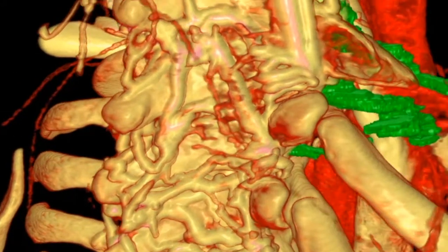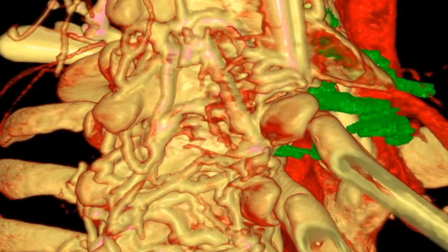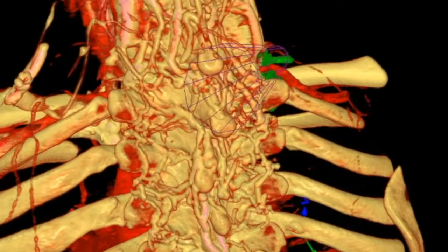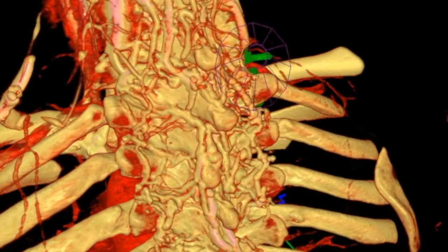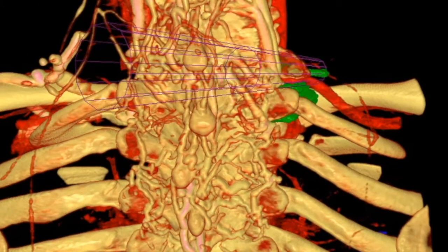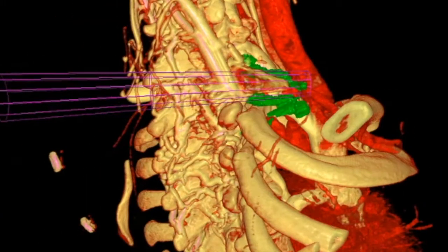As we rotate around, trying to find the optimum entry point to approach the rib, we now mark a tube first coming at the rib from a medial to lateral approach. We then look more laterally and see a lateral approach would work better.